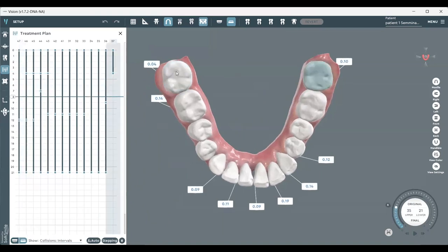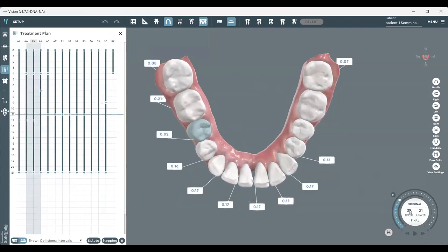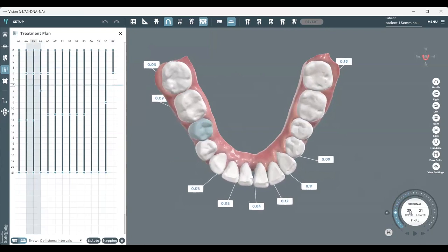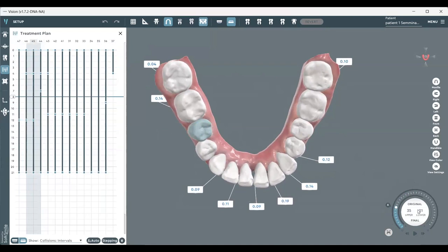because we are going to create pressure here. And that will make the aligner create more pressure on the premolar sides. So we expand the premolars and contract the seventh. And you can see how there is a space between the molars and premolars during this process to be able to open the spaces correctly.